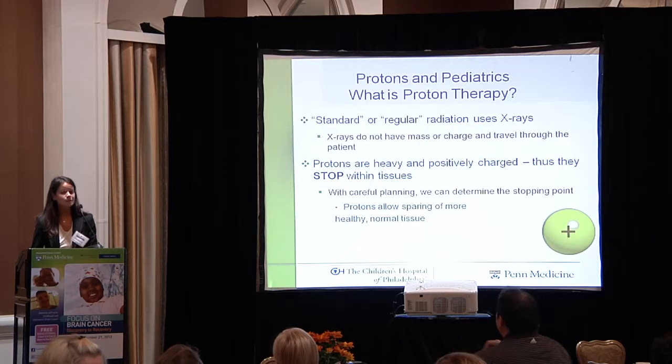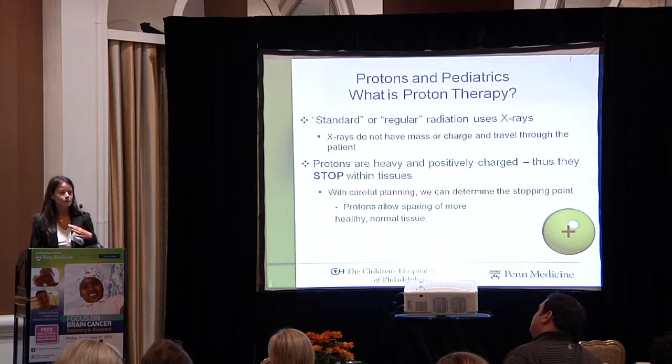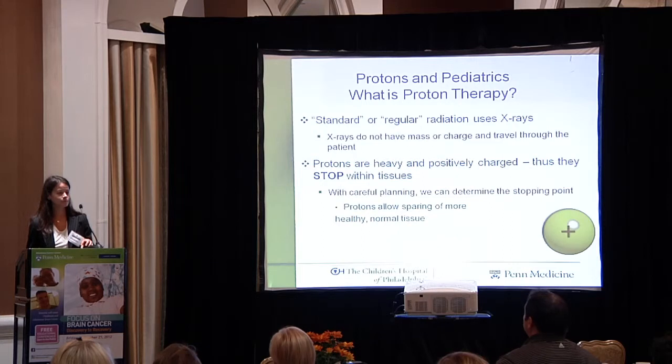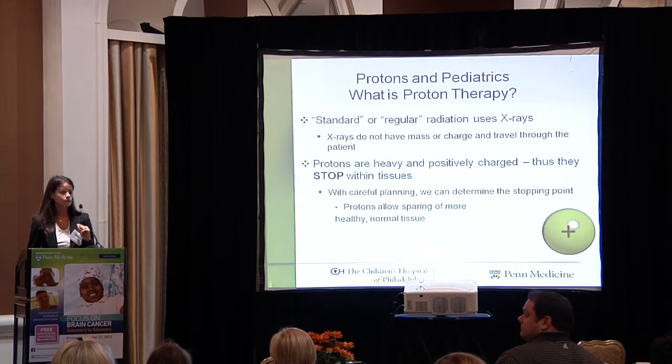Protons, in contrast, are actually particles, and because they're particles, they're very, very tiny, but in the world of radiation therapy, they're actually heavy and they have a positive charge, and for that reason, they actually stop within tissues. And with careful planning using both computer software and mechanical hardware, we can determine exactly where we want them to stop. We can make them stop in the tumor. At the point where they stop, they deposit a whole lot of their energy, and I'll show you a graph of that in just a minute. And then they don't exit the patient, and so you're able to spare all that normal tissue that would normally be exposed to radiation through the exit radiation dose.